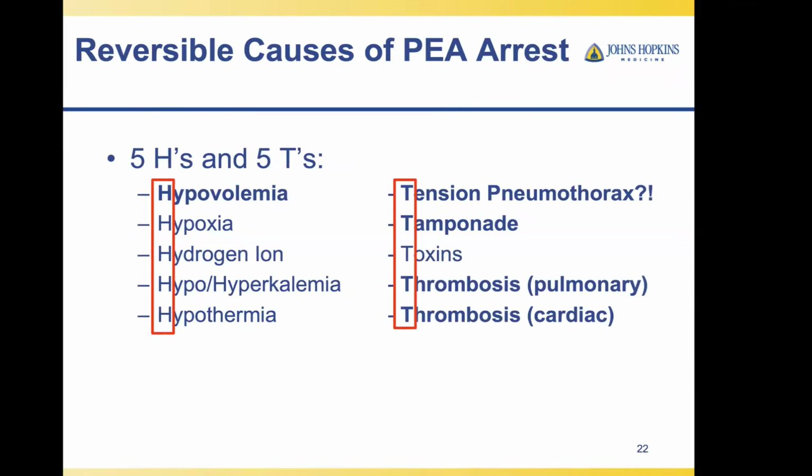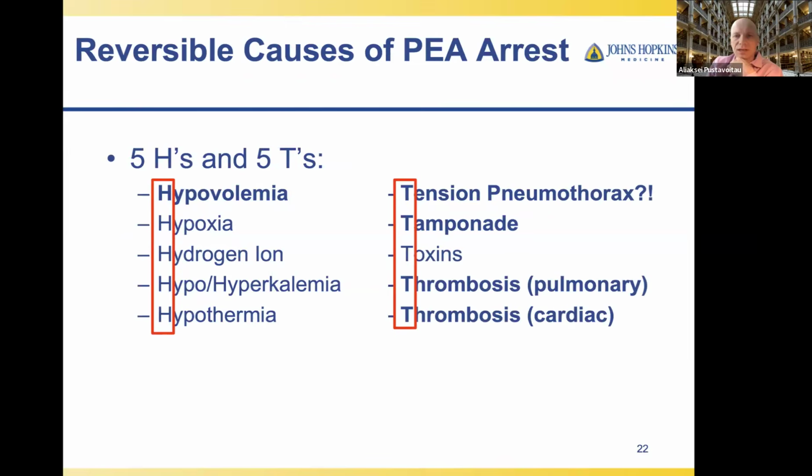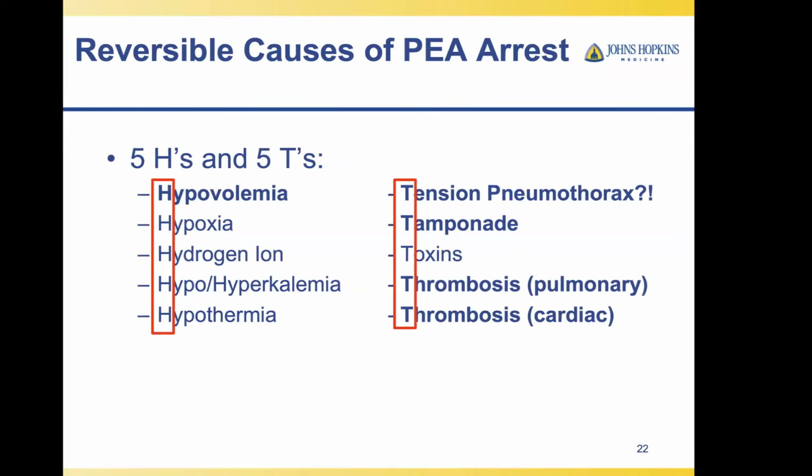These are the classic 5 H's and 5 T's of PEA arrest. And I highlighted, I bolded, those that can be seen by ultrasound.